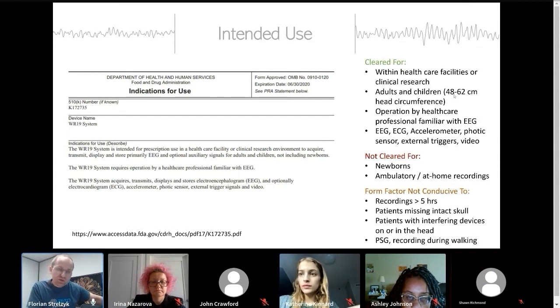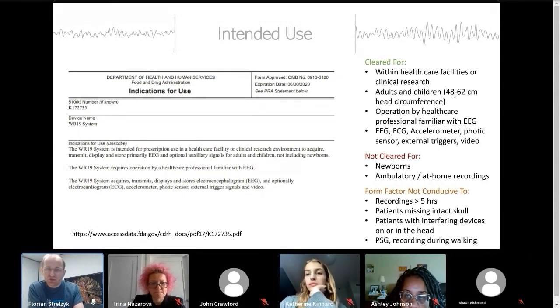And a lot of what we'll be talking about, keep that in mind. So I don't want you to misunderstand that we imply usage elsewhere. So we're not good for EMUs. We're not good for these long-term 72-hour studies and those type of things. We are not here to replace the entirety of EEG. We're simply here to fill a gap that exists in many clinical operations where there simply is no 24/7 coverage. And better than most, time is brain with these patients.